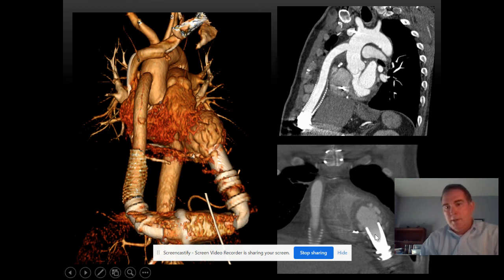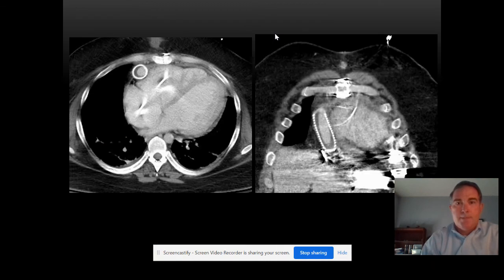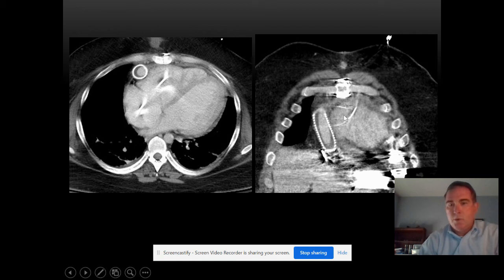Sometimes the angle of the left ventricular conduit can get bent towards the septum, so blood's getting sucked out here. It can suck on the septum, so watch that angle if you're doing a CTA of that for complication. Again, that's that bend relief. That's not thrombus. It's normal appearance.